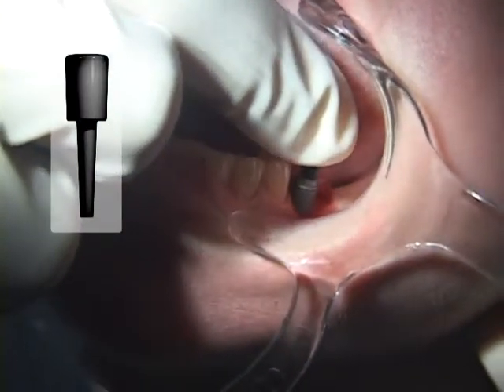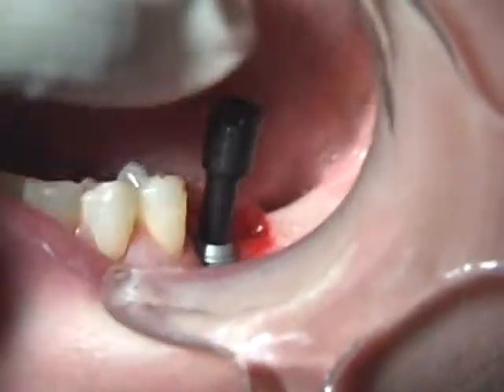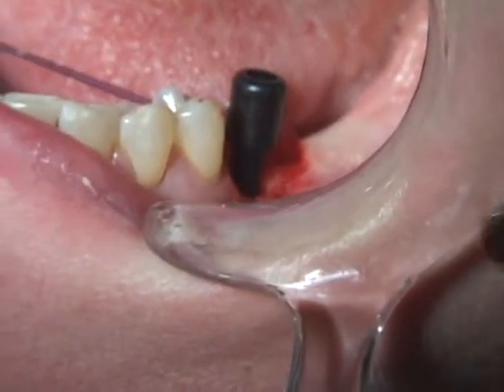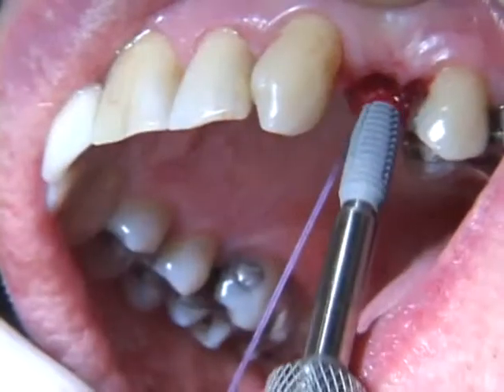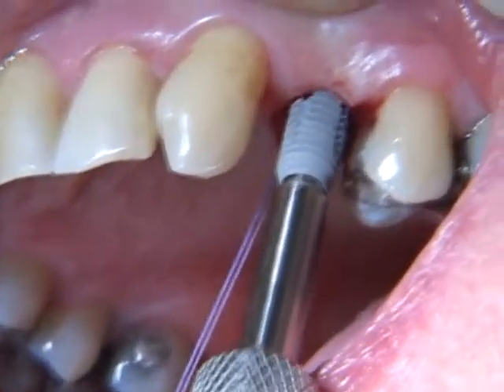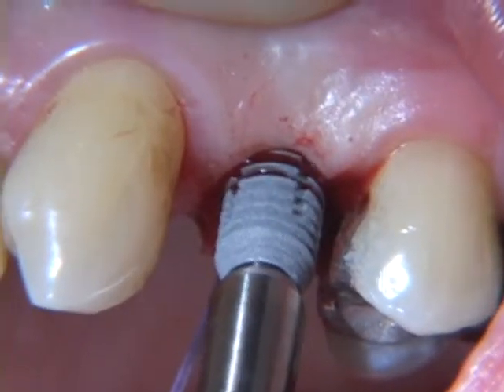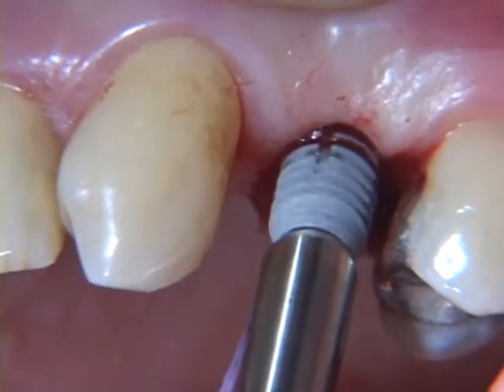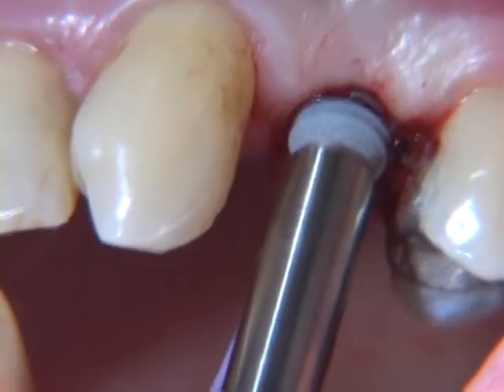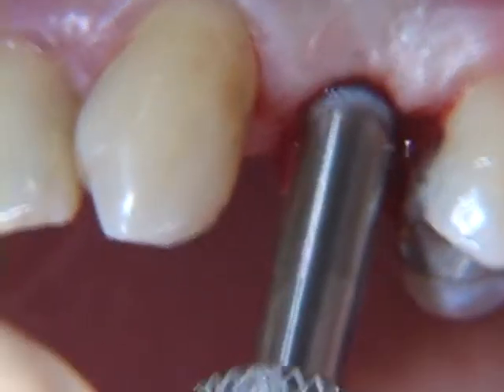Grasp the healing plug inserter with gloved fingers or forceps and insert the implant into the prepared socket. The implant should not touch anything prior to being placed into the bleeding prepared socket. The socket is not flushed because it is desirable to have an undiluted blood clot form within the implant placement site. Rotating the assembly while pressing apically during seating will help to fully seat the implant. The implant should be wet with blood during seating.